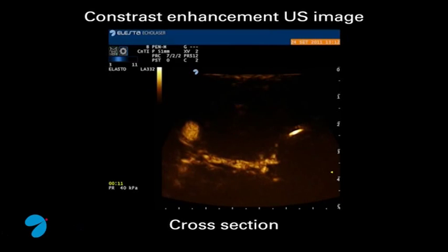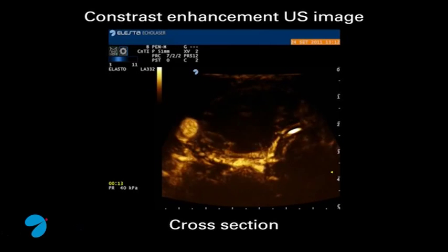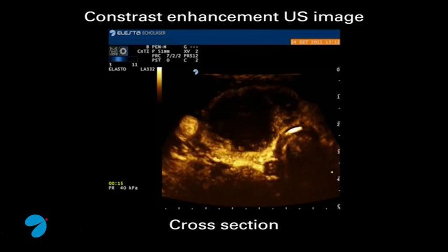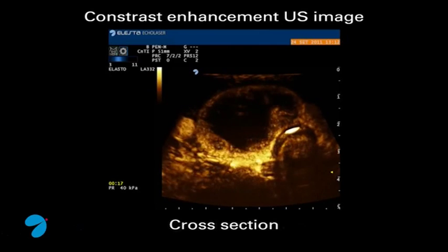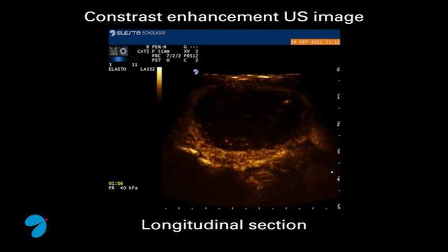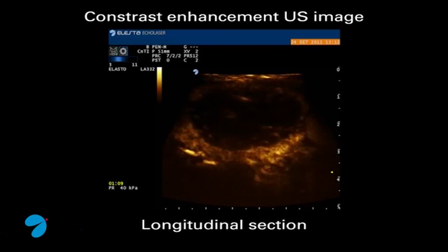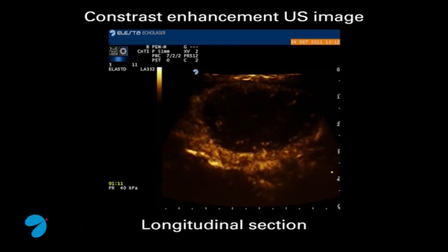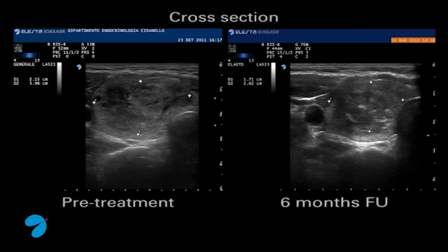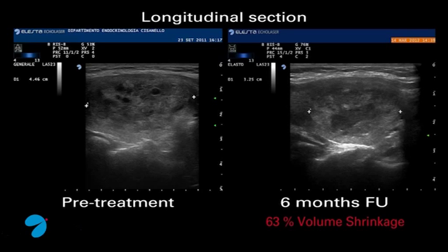In the clip, you can see the contrast medium perfusion in the peripheral part of the nodule and its absence in the central part, due to destruction by the laser treatment. Ultrasound images of the nodule in transversal and sagittal planes show a sixty-three percent volume shrinkage at six months after treatment.